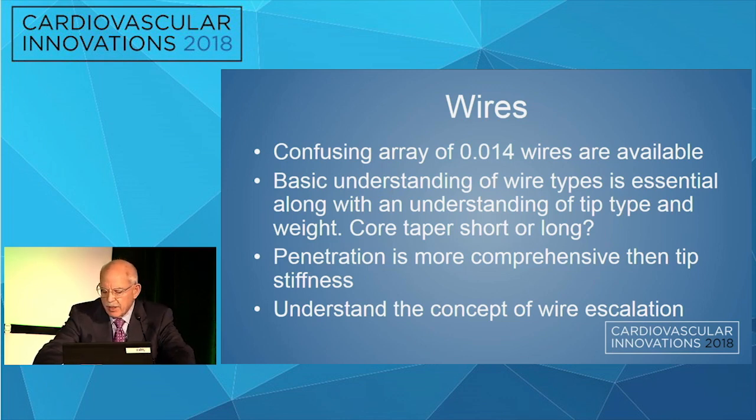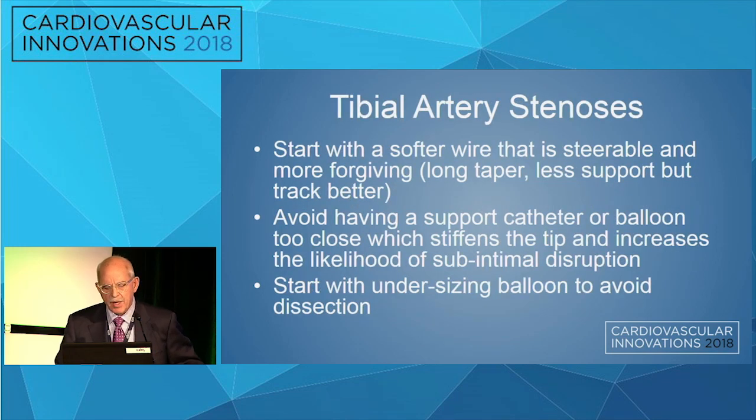Certainly for those of you who are doing CTOs in the coronary bed, a lot has been done. There are some very elegant YouTube videos that Dr. Lombardi has done, for example. It gives you a big sense. And this is something that's relatively new to the peripheral world that we didn't spend a lot of time on.